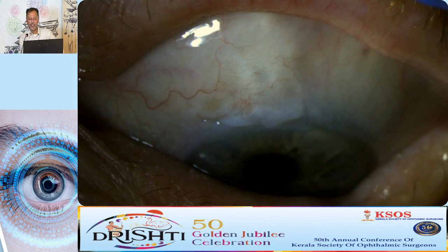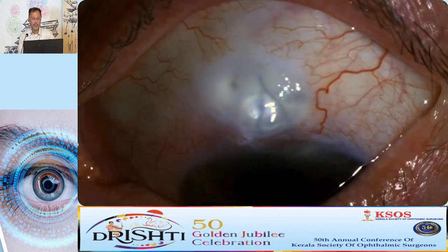And you can see this is the sort of cataracts that we do back in the UK. Unlike the ones that you guys were doing trabs on, they would have had their cataracts a long time earlier. And this is a lovely bleb, and you have to have a strategy to operate on someone like this. Here again, I'd probably use a mitomycin in the area where there's no bleb, but I'll definitely give some intraoperative mitomycin and just make sure that you have a clean surgery.